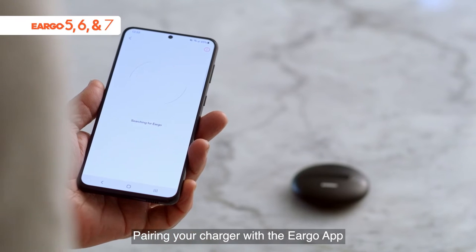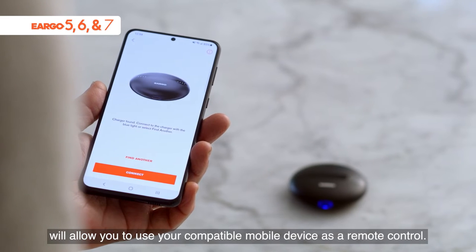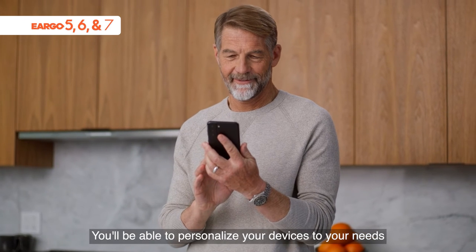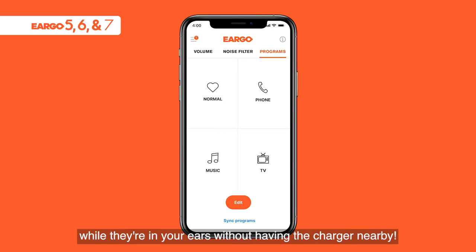Pairing your charger with the Eargo app will allow you to use your compatible mobile device as a remote control. You'll be able to personalize your devices to your needs while they're in your ears without having the charger nearby.